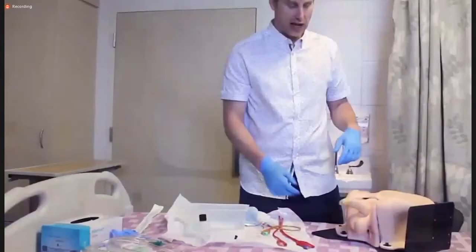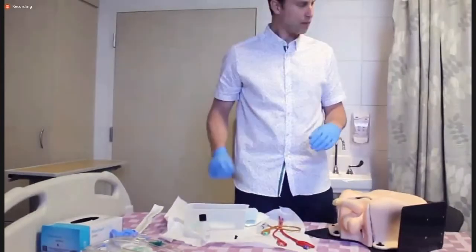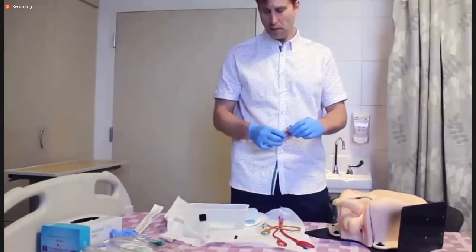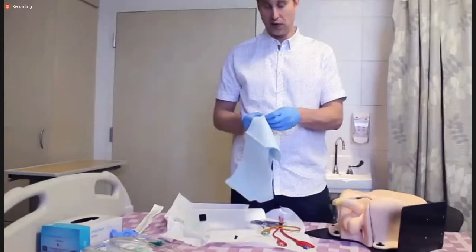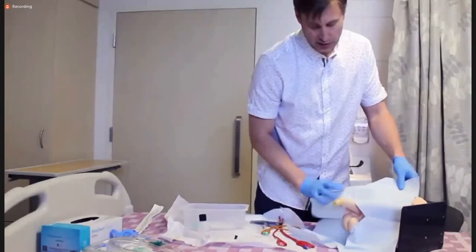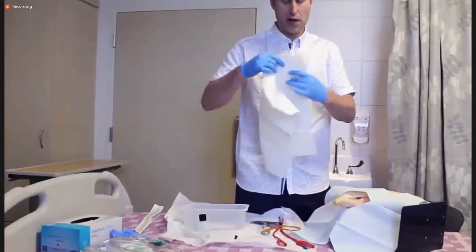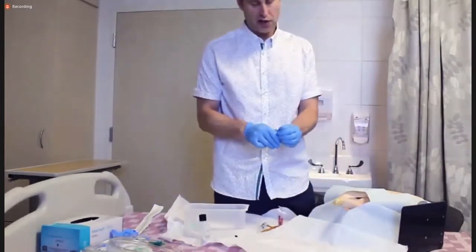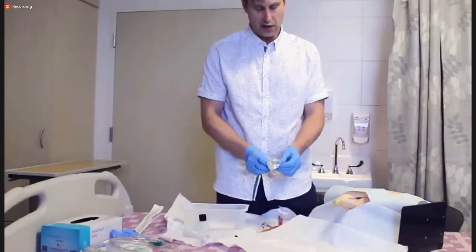In this instance, we have a patient here in dire need of a urinary catheter. So our first order of business after preparing the sterile field is to prep the patient and then prepare for the sterilization part of the procedure. We have a catheter drape, which in this case we'll put over the patient's genitals. And at the very same time, we'll put another one up at the very bottom to kind of create our sterile field.